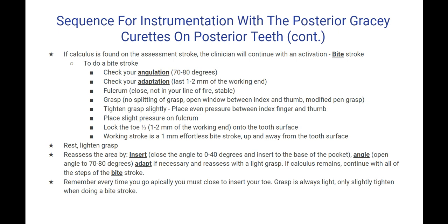If calculus remains, continue with all of the steps of the bite stroke. Remember, every time you go apically, you must close to insert your toe. Grasp is always light, only slightly tightened when doing a bite stroke.